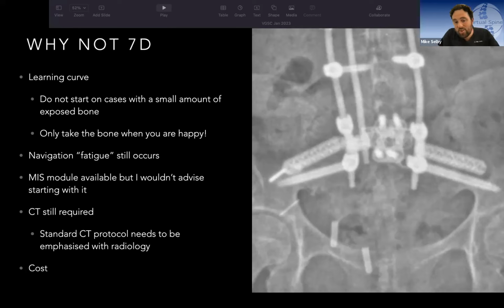screw. And look, one of the challenges with doing that kind of pelvic fixation is you need to essentially mallet the sacroiliac joint device across the joint. We're now working on ways to stop that, because when you mallet it in, it does decrease your accuracy. I should have reflashed, but I didn't realize, and I was moving quite quickly. I only realized when the screw didn't feel quite right going in the SIJ, didn't have quite that grip, that there was a problem. Just checked it on X-ray and found that.